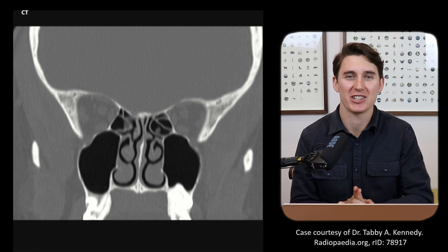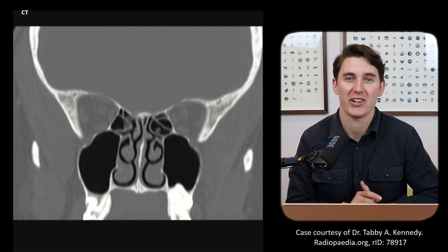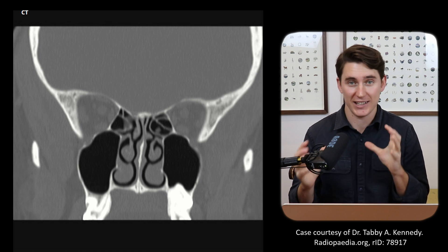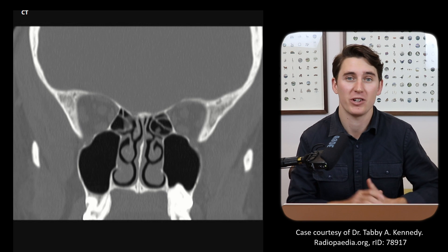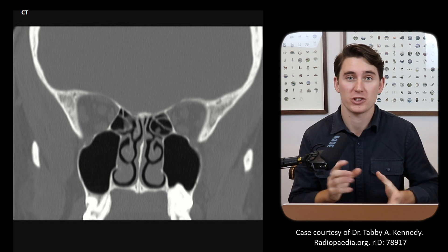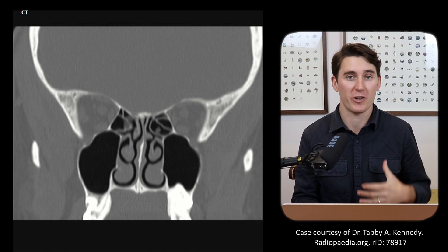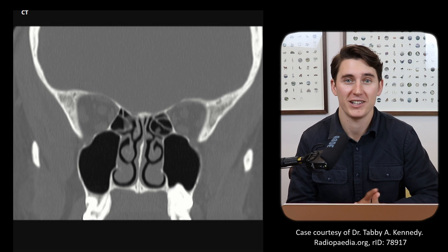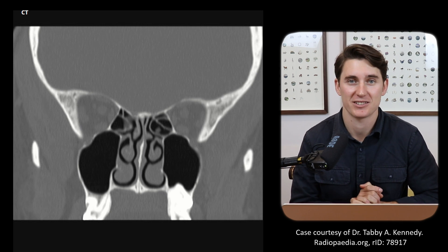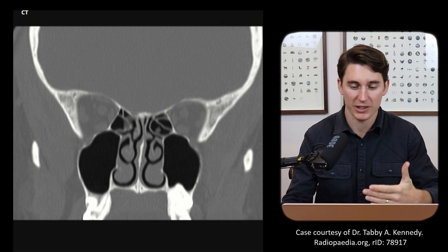Hello everybody and welcome back to another radiology tutorial. Today we're going to be discussing the anatomy of the paranasal sinuses. We're going to look at how they relate to the nasal cavity in space, how they communicate with the nasal cavity itself, and also look at a couple of important surrounding structures that we may need to warn surgeons about before they go operating within these paranasal sinuses. So let's start by identifying and naming them on a scan.